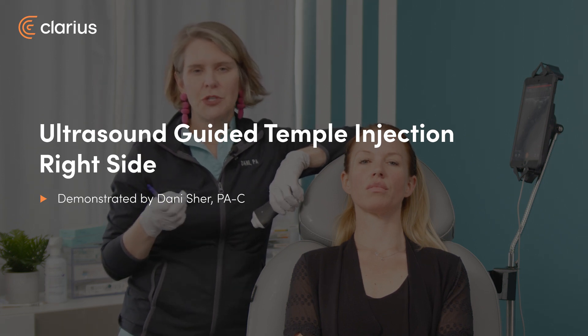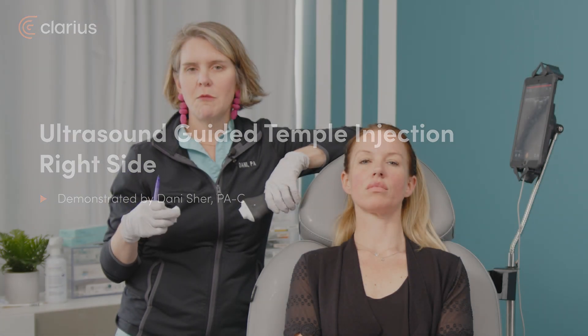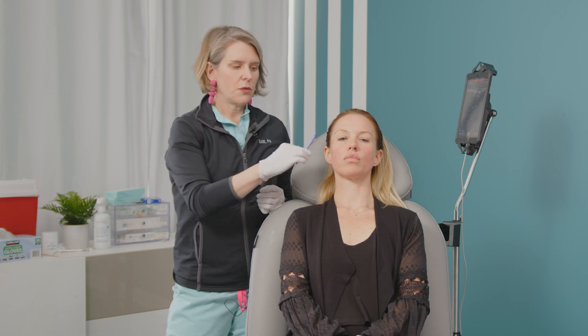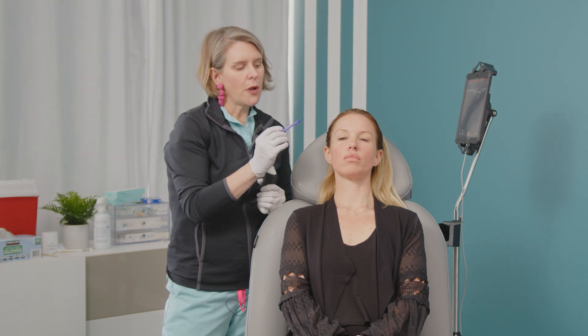Hi everyone, I'm Dani Scherer, I'm a physician assistant and I'm going to show you ultrasound guided temple in layer two. The reason why I don't typically safe map the temple is because it is high risk and it's easy to get a live guided visual. This area has potential for causing blindness. So if it's easy to get a live guided visual and it's a high risk area, that means it's an area I recommend doing ultrasound guided technique rather than safe mapping.